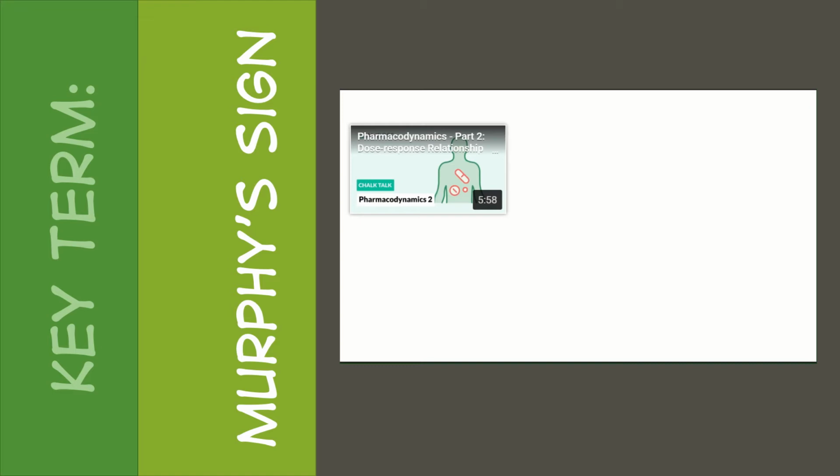Now, some downfalls to diagnosing that positive Murphy sign is that a lot of times those patients are going to be coming into the ER and they're in so much pain, and quite often they're going to get something called a GI cocktail. And in that GI cocktail is some pain medicine. And so their positive Murphy sign might be a little dulled because of that pain medicine. The other thing is that we are right on the ribs when we're doing this. And if you're adding enough pressure, some people just have very sensitive costal ridges, and just being on the ribs can be kind of painful. So you want to make sure that if you're calling it a positive Murphy sign, that it is from pressure on the gallbladder as it slides underneath that transducer. That is what's going to elicit that true positive Murphy sign.